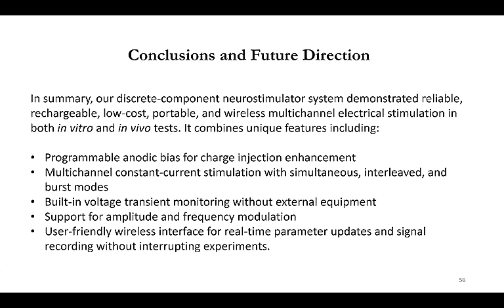It is easily accessible and easily programmable. And everything in these studies, the PCB, user interface, and canister, is custom designed. That means we can easily adapt it based on the application.